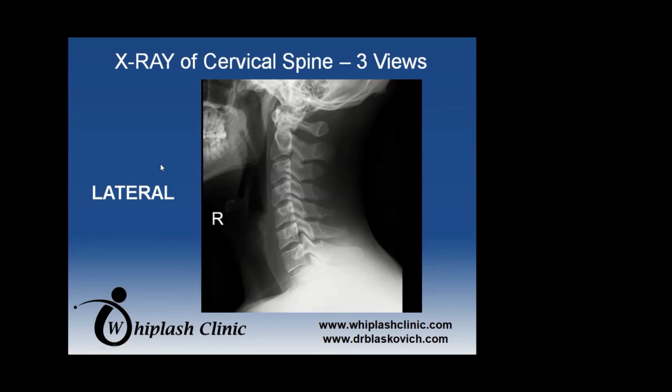They could get them to move their arms out in front, one arm out back, and they call that a swimmer's view, which then gets the shoulders out of the way so that the denseness of the shoulders is no longer in the way of imaging C7. But for this particular X-ray, C7 is pretty well visualized, except I would say the spinous process is kind of overexposed, if you will, or underexposed, I guess. Okay, does that make sense?